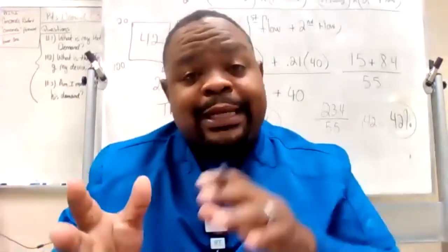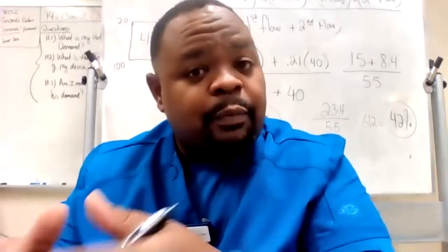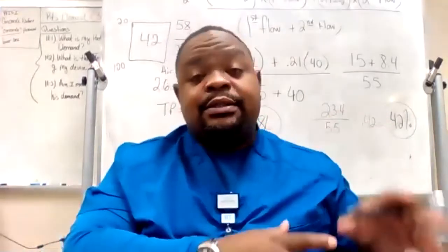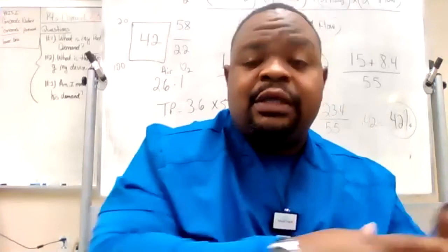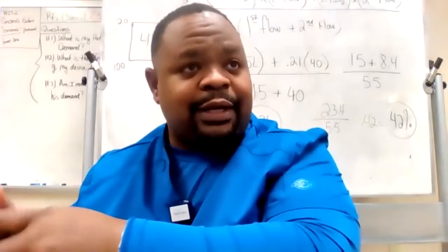Now, they do it in two different ways. They either measure the partial pressure, which will be in millimeters of mercury, or they tell you the actual percentage. Some of them will report in partial pressure, some of them report in percentage. And that's what you got to know.